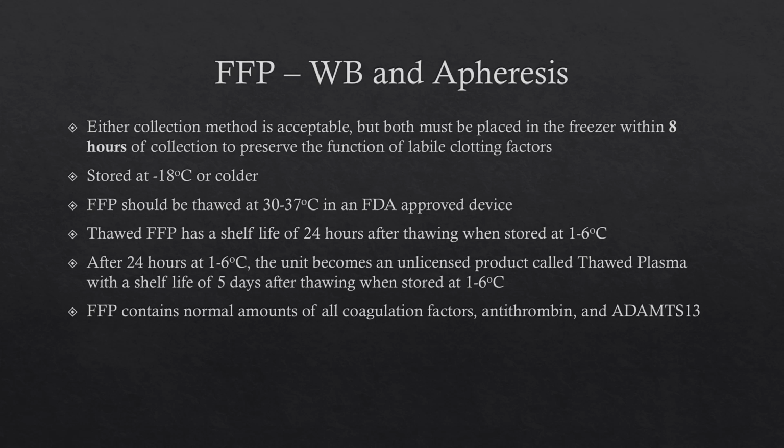After 24 hours, it becomes another product called thawed plasma, which has a shelf life of 5 days. But that first 24 hours is when you have the best, you preserve the most function of your clotting factors and other plasma proteins.